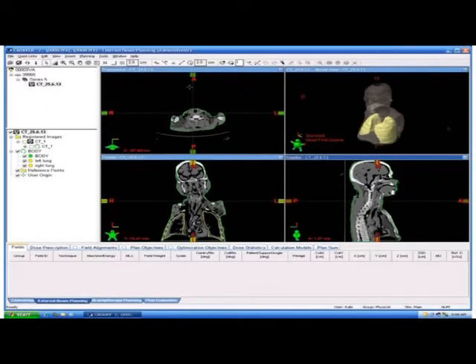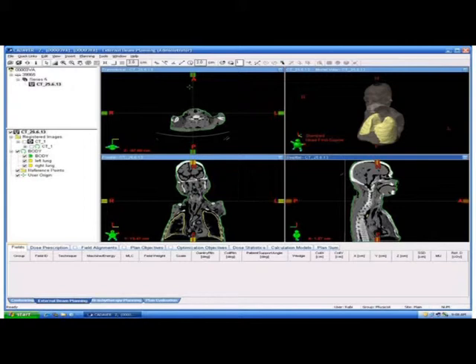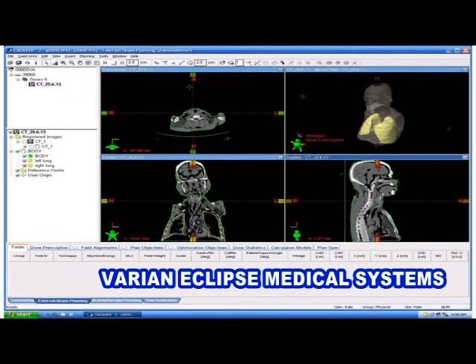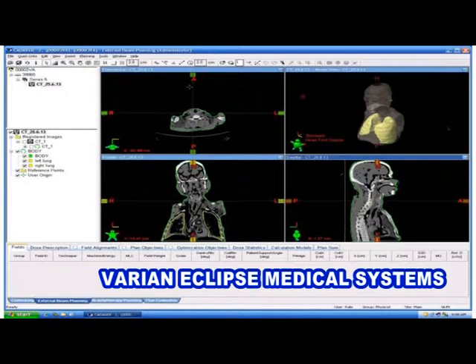The images of pre-plastinate and post-plastinate were then compared for anatomical accuracy, volume of organs, and CT numbers in Hounsfield units on a treatment planning system called Varian Eclipse medical systems in the Department of Radiotherapy, as seen here.